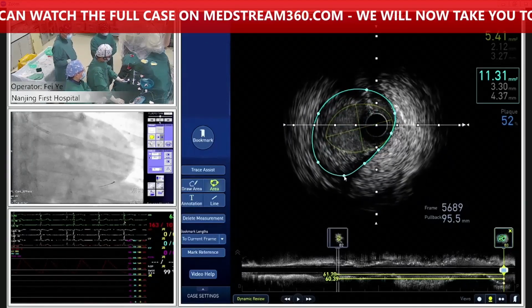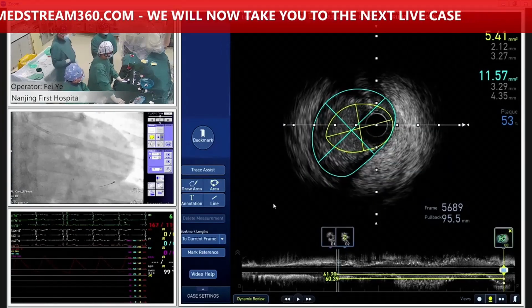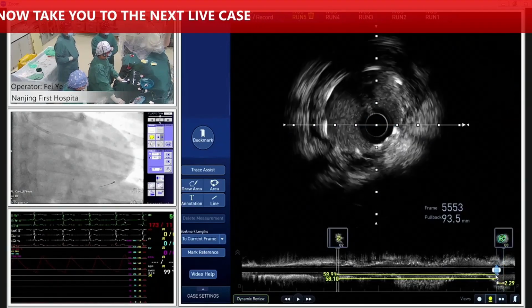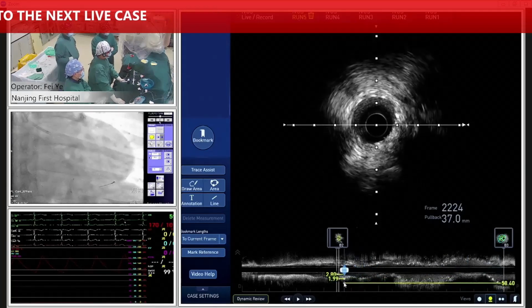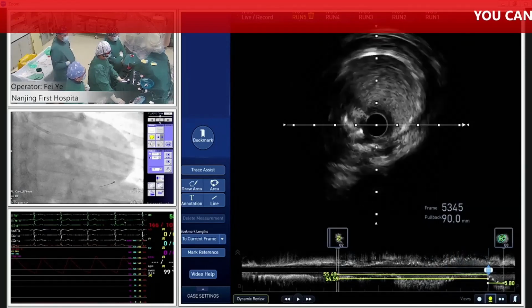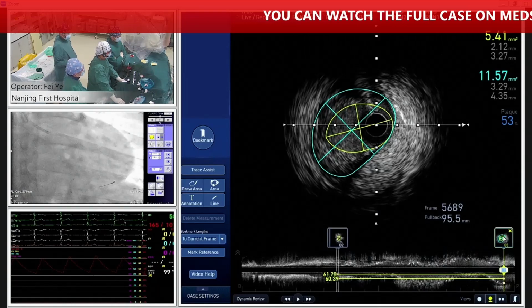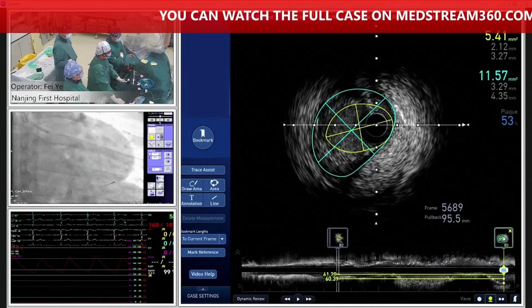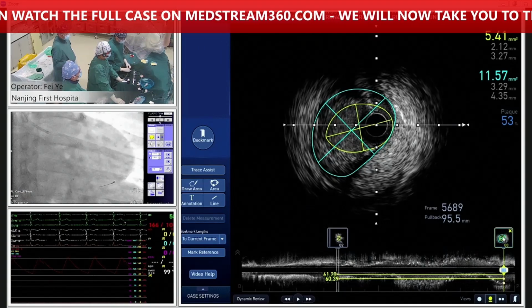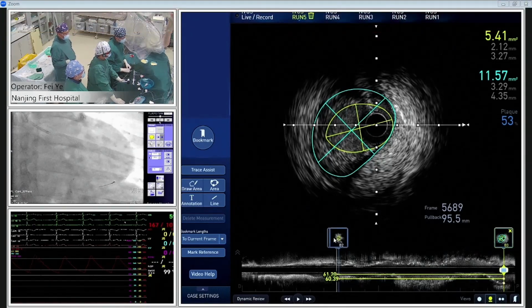So could you measure the stent expansion in the distal and the proximal part and the middle part? For the proximal landing zone is optimal. Less than 55% plaque burden. 53, yeah. So this is a proximal part stent landing zone. Okay. The MSA was 5.40. Okay.